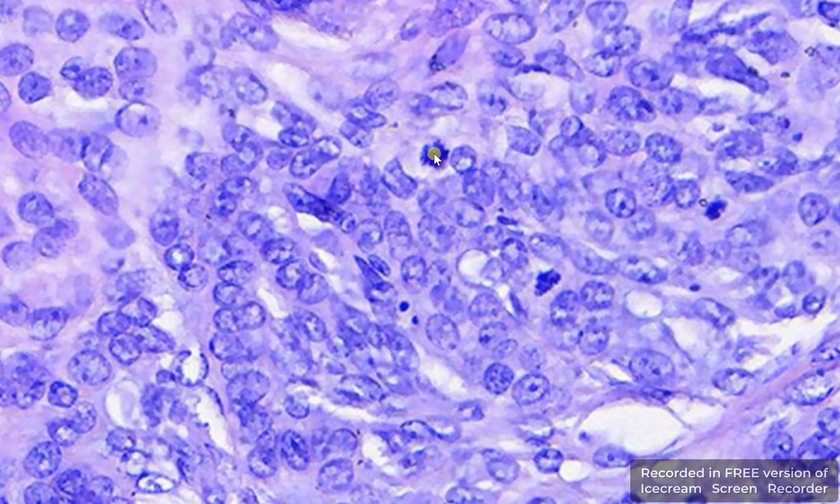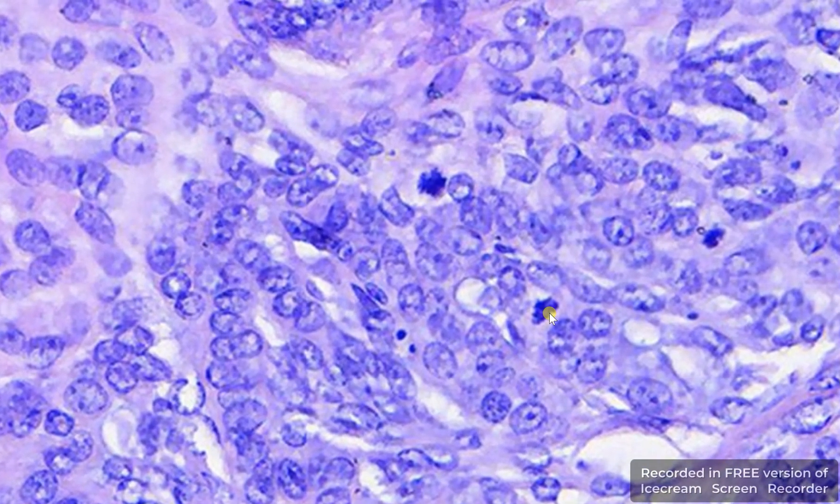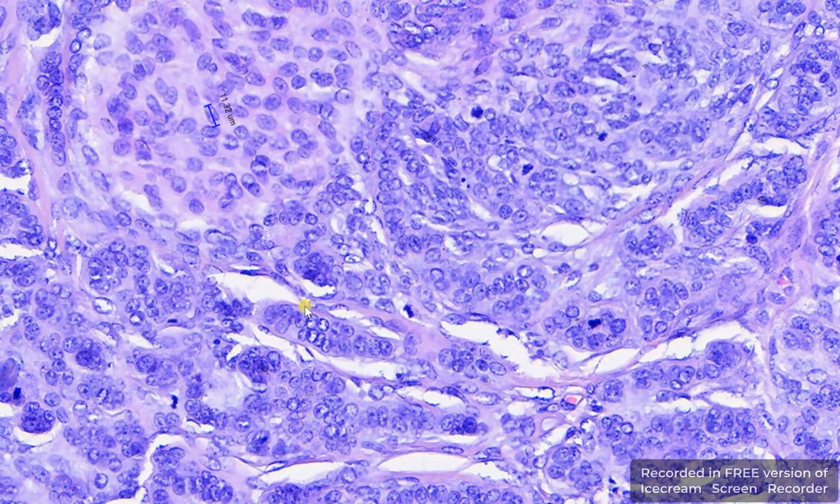If we go a bit closer, you can see here how the mitotic figures look at high magnification in this epithelial neoplasm.